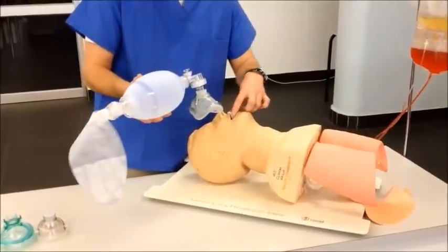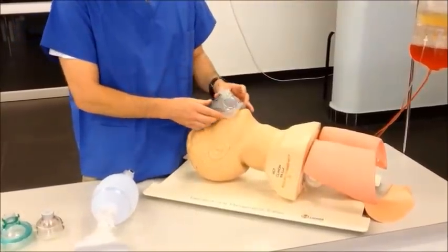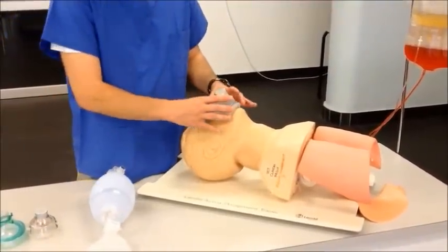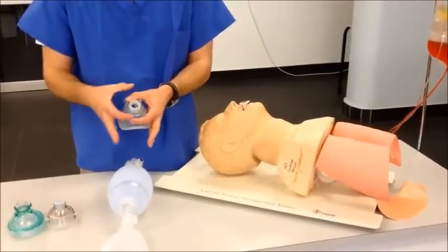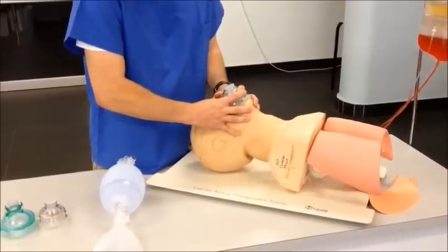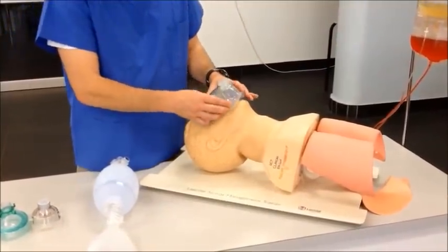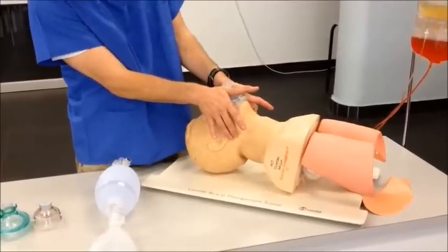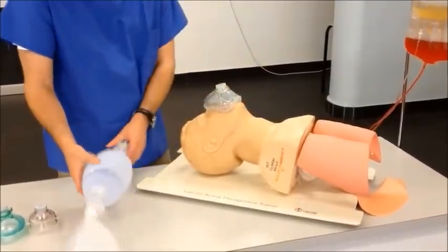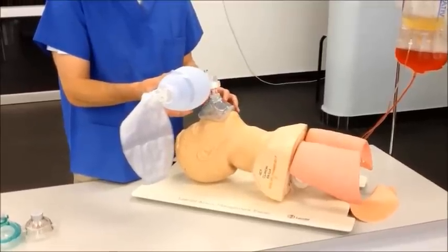In the case of two rescuers being available, you may want to consider a two-handed grip with one rescuer applying the mask to the face and a second rescuer doing the ventilation. The first way you could do this is to simply reproduce the CE grip with the other hand, using a double CE grip that allows a very secure grip of the mask to the face. Alternatively, lay the sides of the mask against your thenar eminences and then grip behind the angle of the mandible in a modified jaw thrust maneuver. At this point, your assistant would connect the bag and ventilate while you maintain the grip. Consider switching roles if fatigue sets in.